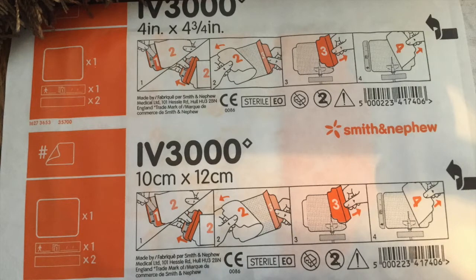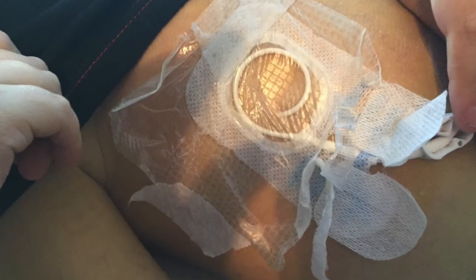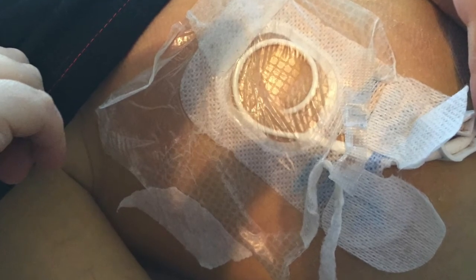After the first one, I put this second patch on — it's really just the best tape because my skin is so sensitive. It puts another barrier on my central line so the tape doesn't come off as easily, it keeps it staying on better, and when I take it off it doesn't rip off my skin. Combined with the skin barrier, it really helps. It's easy to put on — you just put it on and take the top off. I highly recommend this if your skin is as sensitive as mine. Here I'm taking the tape off before a patch change — it's usually on for about a week before you need to change it.